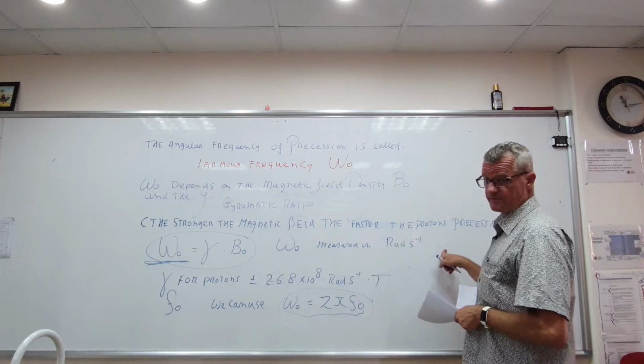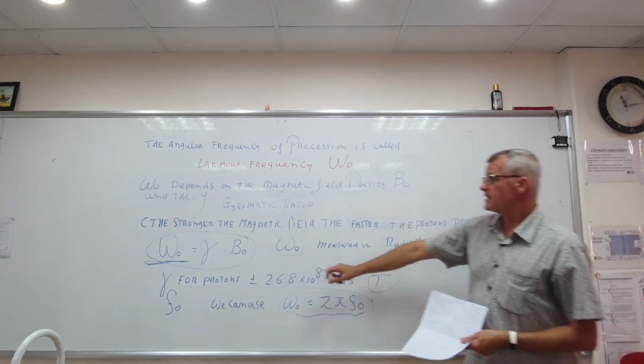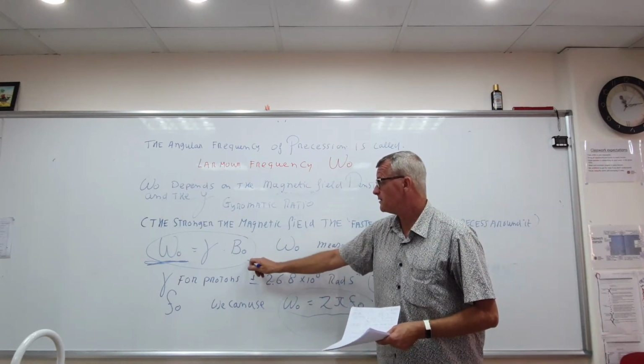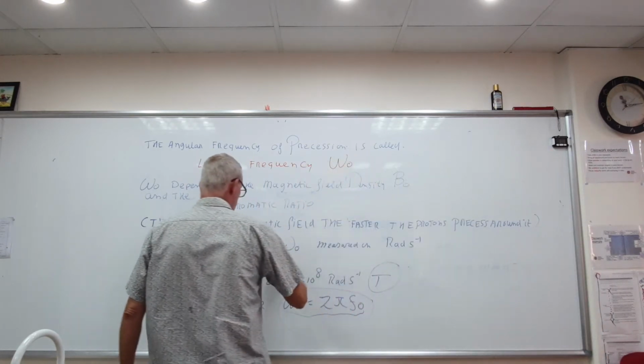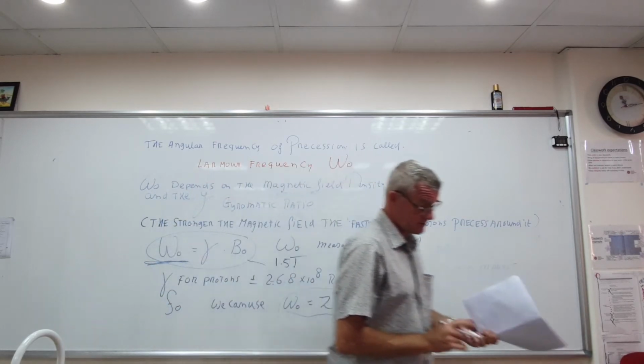Now, as I said before, we use a very strong field, and in most cases we use a field of 1.5 Tesla, which is very strong.